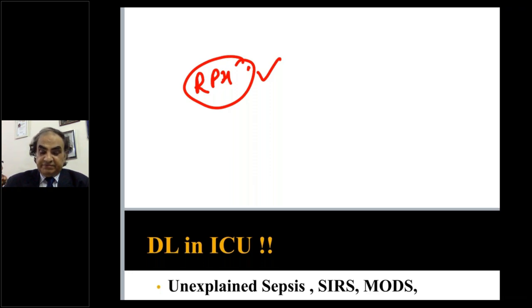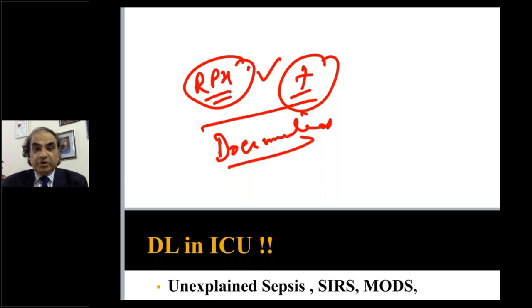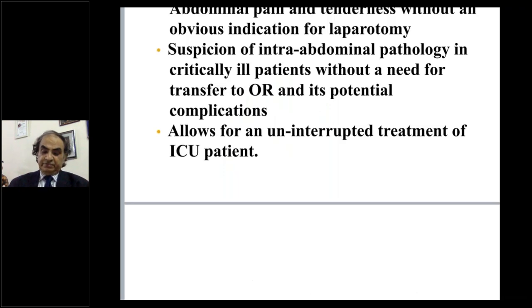But if at all there is a 50-50 doubt, or you are confused and you want to be sure about it, it will form a part of the algorithm, but not routinely. If it's non-expanding, you come out and stay safe. You've at least seen it. But what have you done more than that? You've documented it. A salient point that most people ignore. And diagnostic laparoscopy is incomplete without documentation. Very, very important. So, is there any role in the ICU, which I mentioned? Very much.